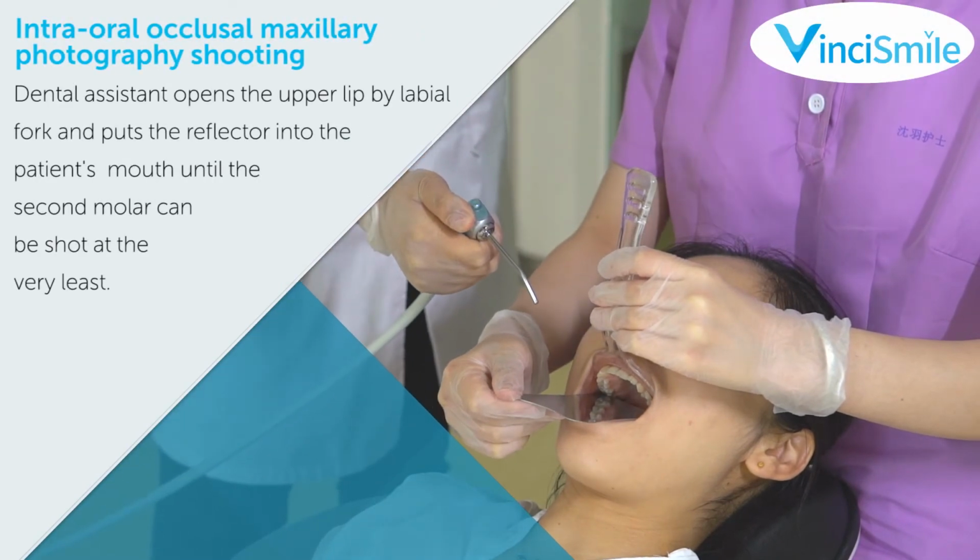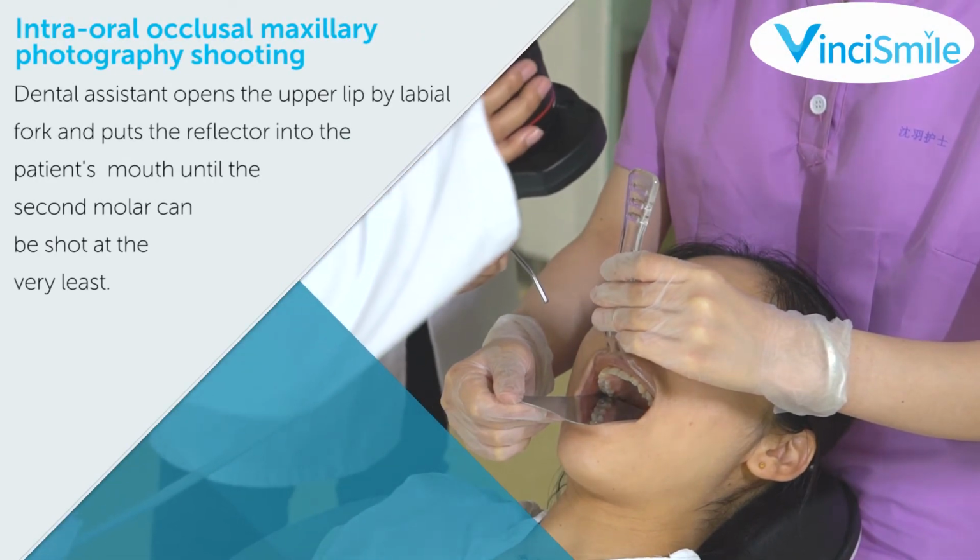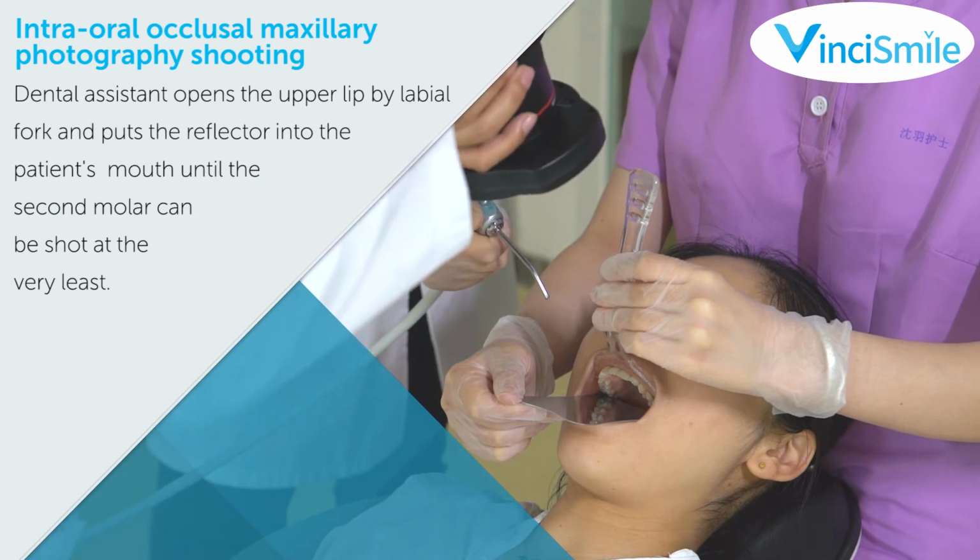Intra-oral occlusal maxillary photograph shooting. Dental assistant opens the upper lip by labial fork and puts the reflector into the patient's mouth until the second molar could be shot at the very least.